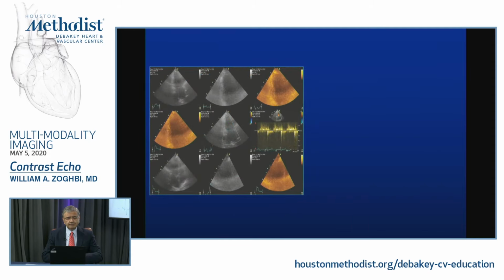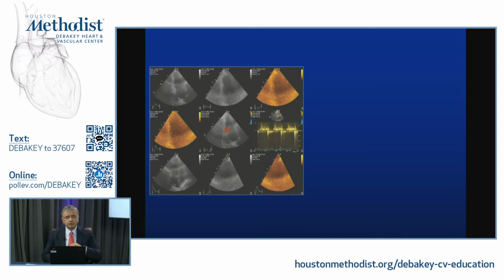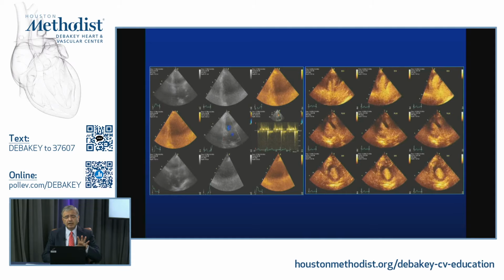I show you this, and we could show many examples, right? As I always ask people, estimate what your ejection fraction is and what your wall motion is. Most people would not venture. I would not venture into that. And it sends a recommendation to people who are not using contrast at all in the laboratory. It really will change things. It's almost like turning the light on, going from an uninterpretable study to quite an interpretable study. So this is the same patient after contrast. So don't tough it out.